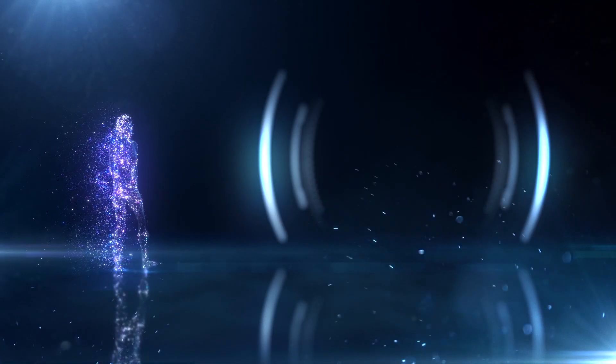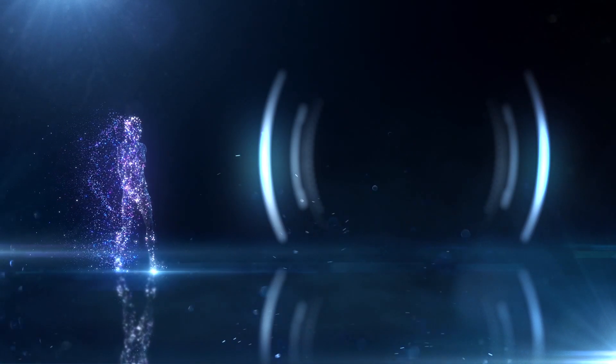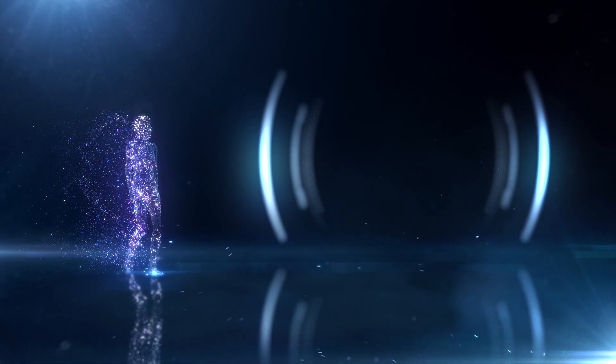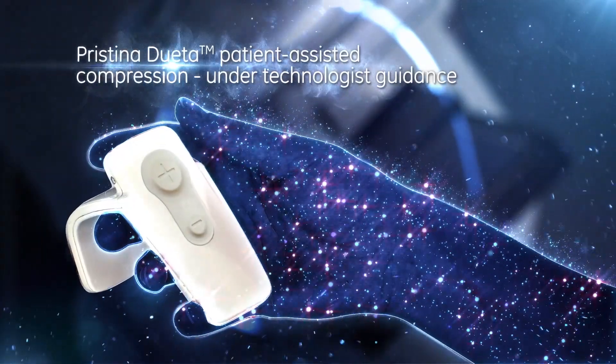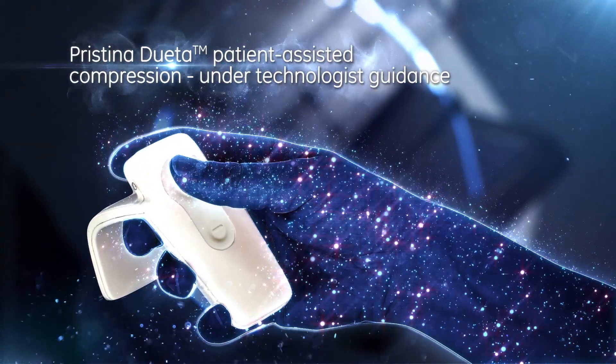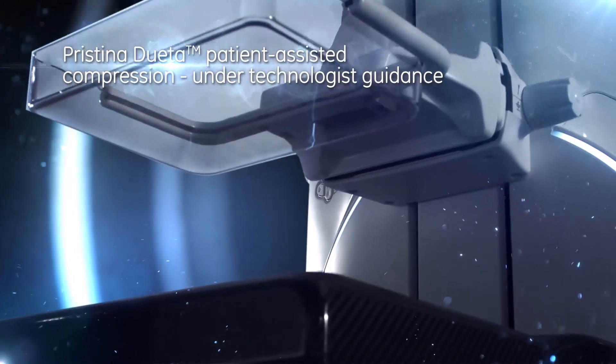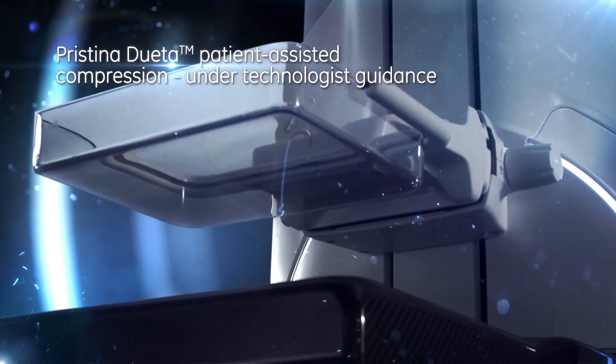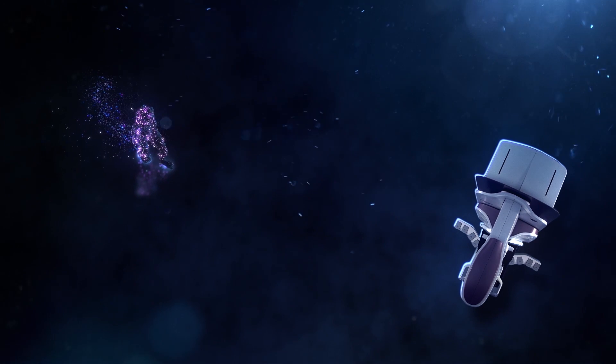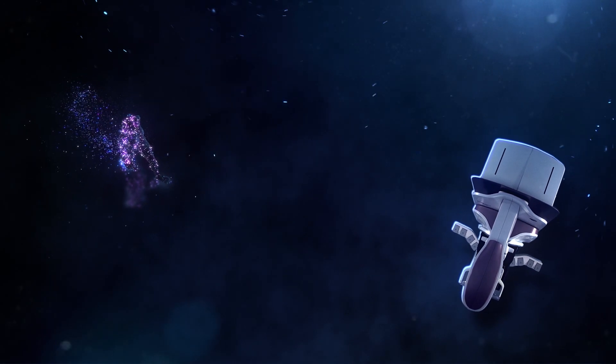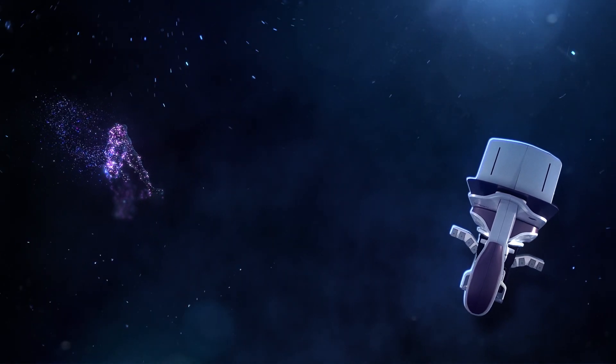For the first time, patient assisted compression technology allows women to gain a sense of control, helping to reduce anxiety and remove potential barriers to effective care.